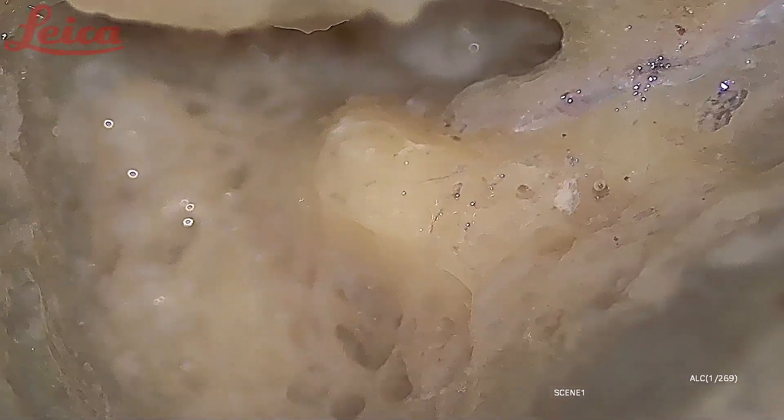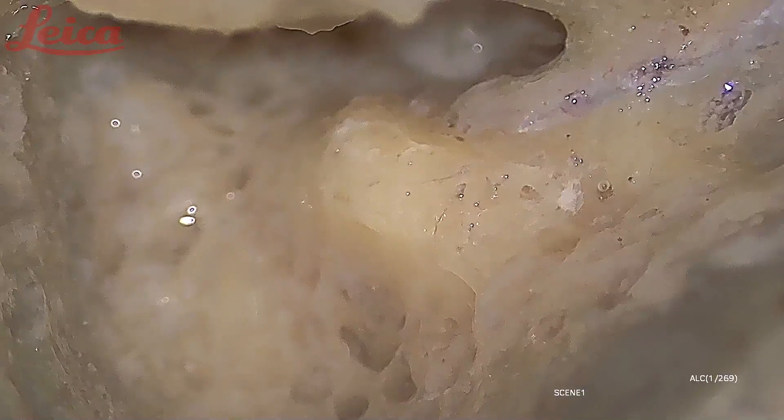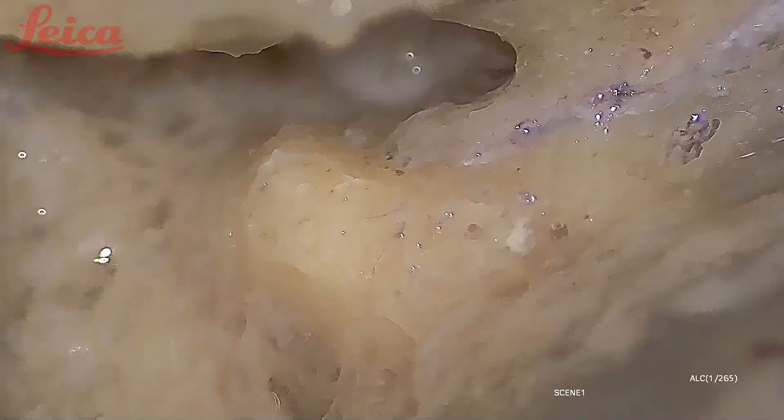The second genu area is a little tricky to delineate, especially when the stapes is intact. You have to be very careful and use a small bird tip to thin out the bone over the facial canal, because on one side you have the lateral semicircular canal and on the other side you have the stapes. You have a very small working distance there to delineate the second genu and the distal horizontal segment. Also, the bone is usually very thin and sometimes dehiscent, so you have to be very careful.